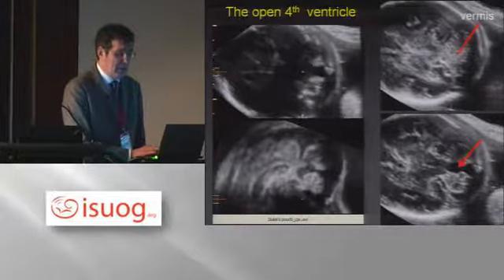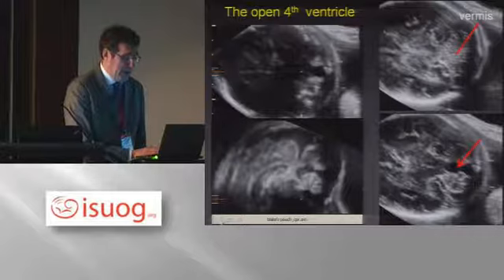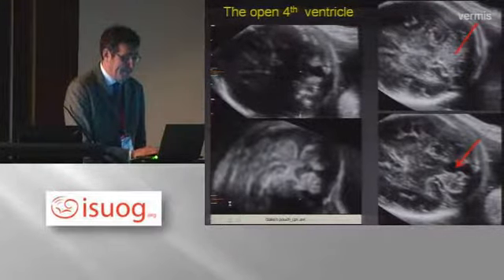This is a three-dimensional ultrasound, and I am using this to make this demonstration to you.